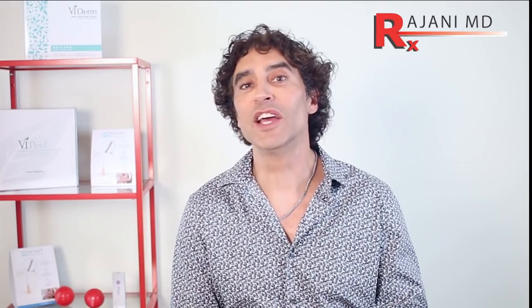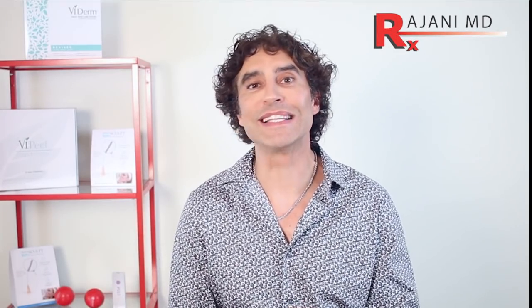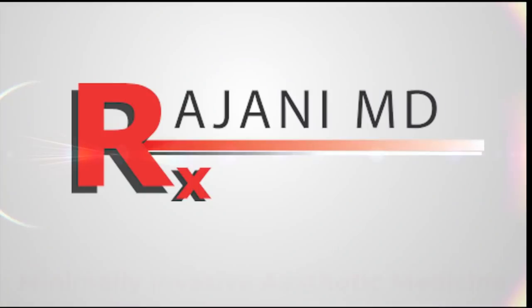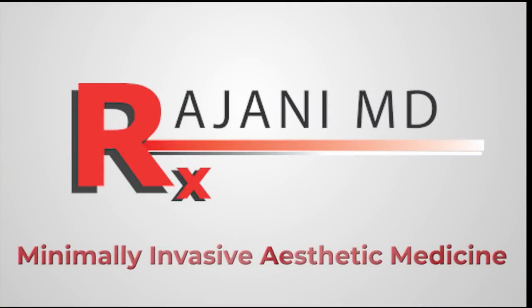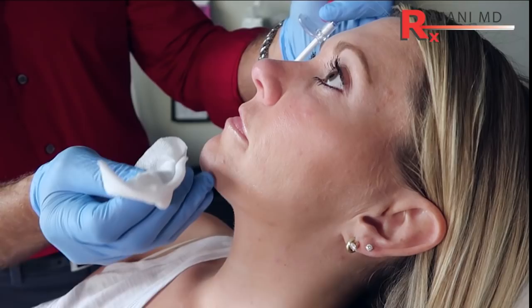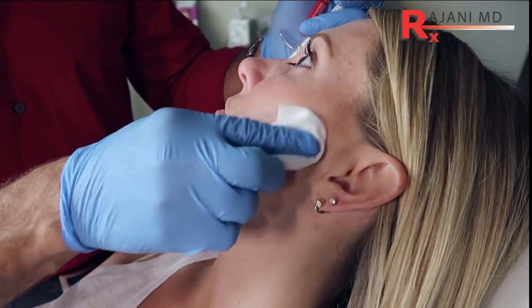Hi, I'm Dr. Rajani, and today we're going to show a treatment and demonstrate Radiesse along the jawline. The jawline is the theme for 2018, so we're going to do jawline with Radiesse.